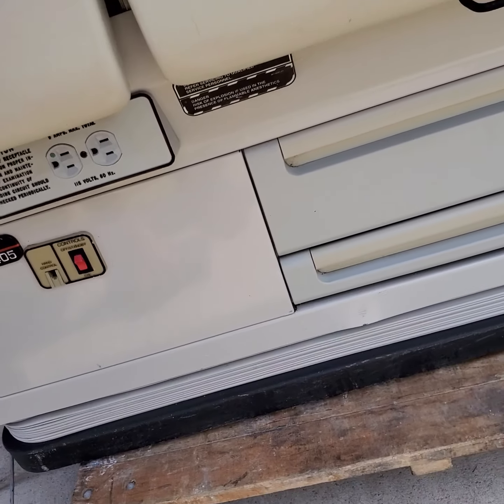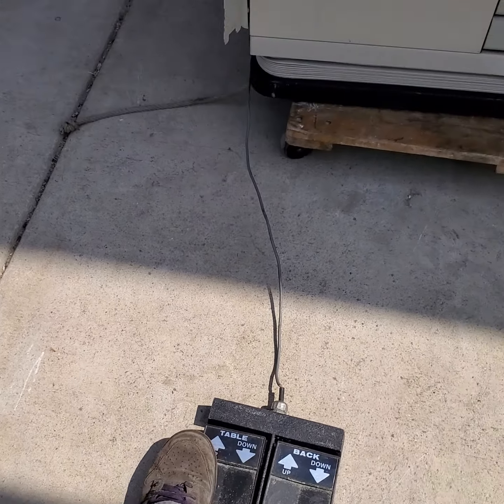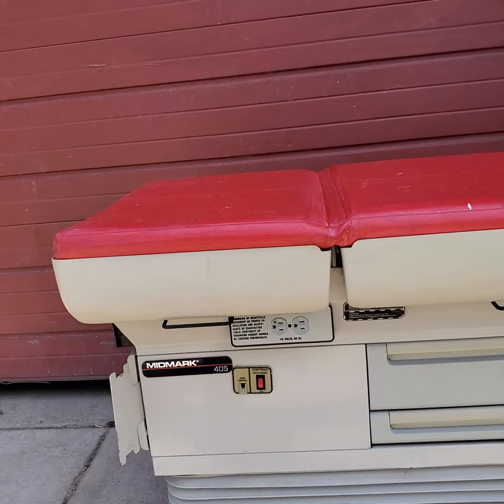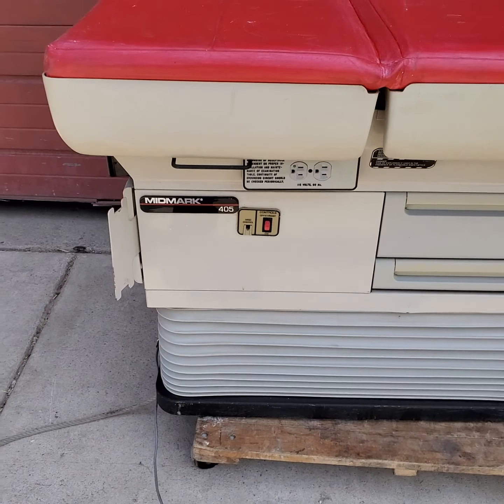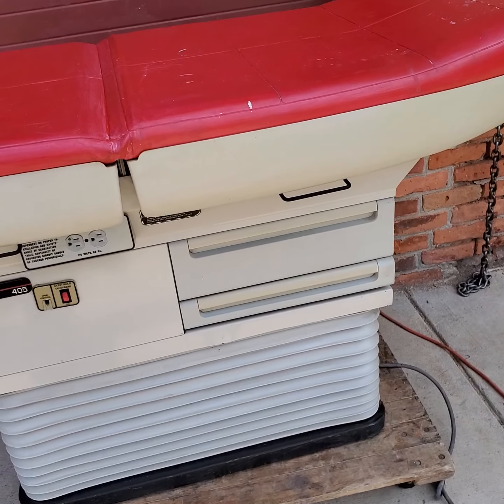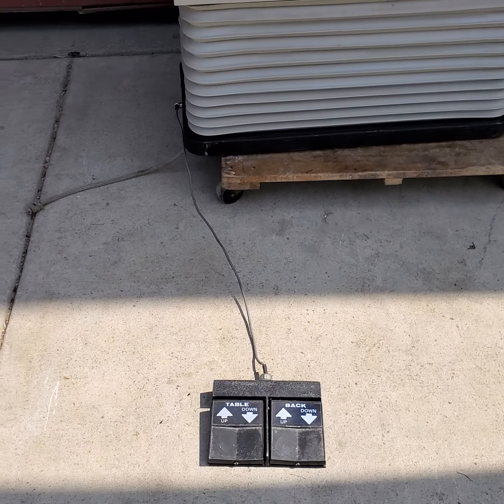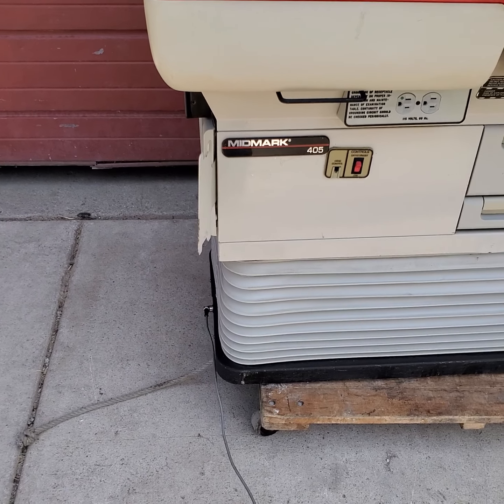The foot control works very nicely. Let's move it up — we're going to put the table up. If you push it up, you see it moves up without any problems. Very silent as well. There's a bracket over there for you to install an autoscope. It goes up. The foot control works well. And let's put it down now — it goes down without any issues either.